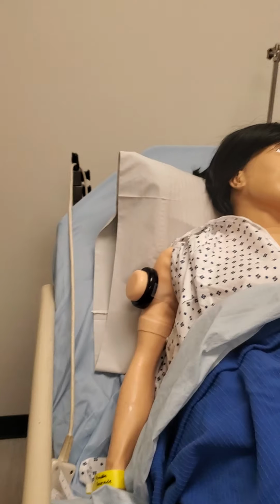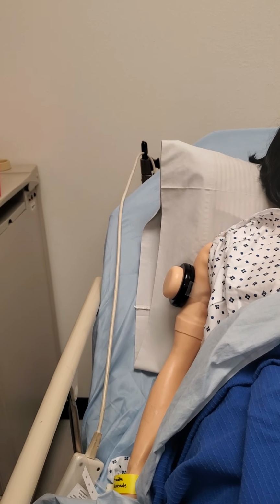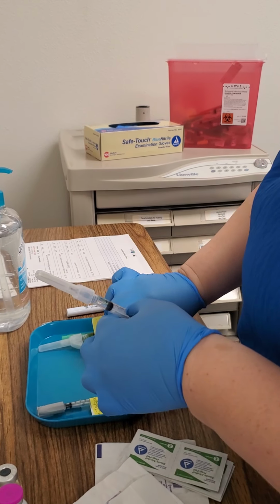Okay. Oh, kind of move this here. Almost lost that. And I'm going to remove my sticker just so it doesn't get in the way of the injection. Okay.